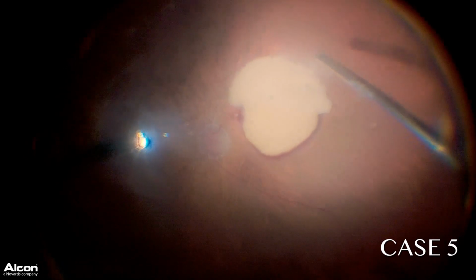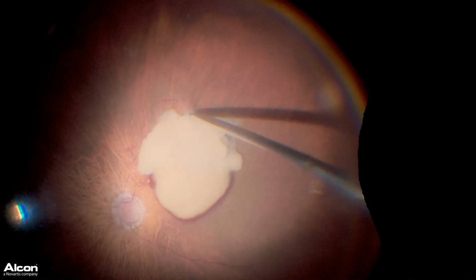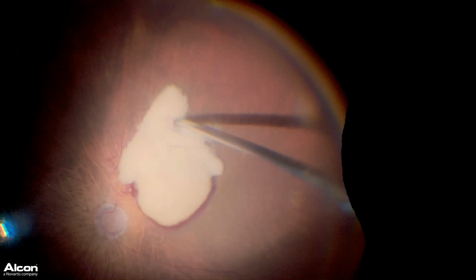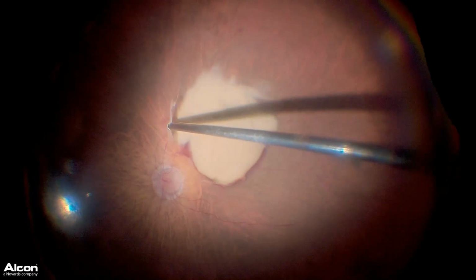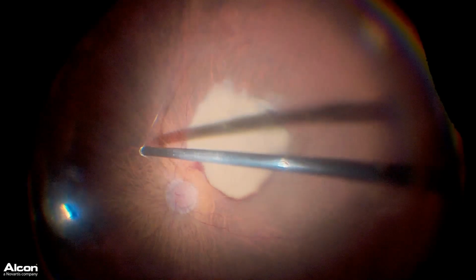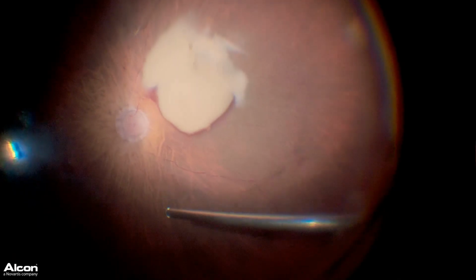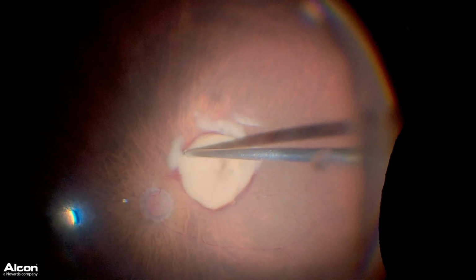In this case, the non-resolving pre-retinal blood was totally dehemoglobinized. Hyaloid removal was done, which exposed the underlying hemorrhage. Gradual aspiration of the same was done with the cutter.